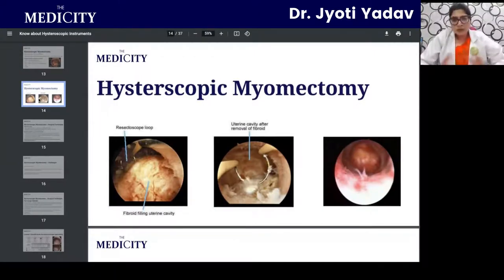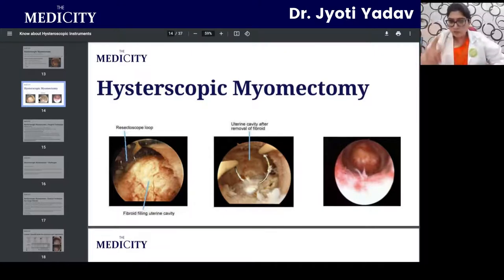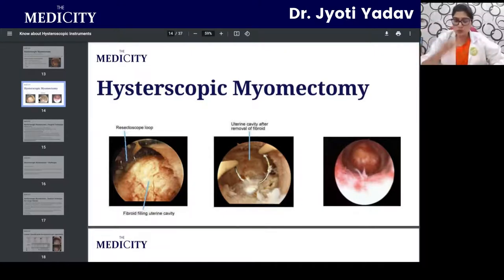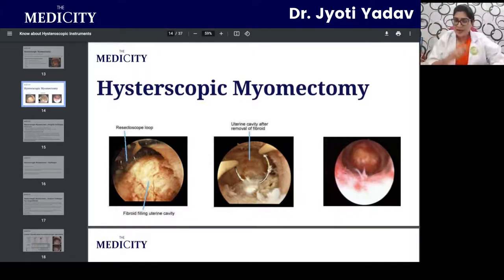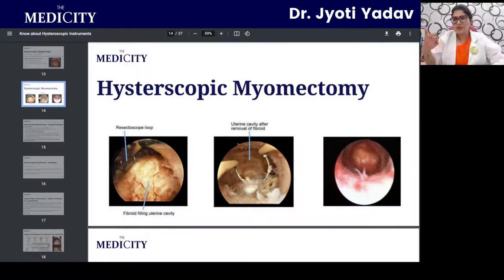Pictures demonstrate how myomectomy is performed: using a resectoscope loop, the myomas are removed in different slices as the loop rotates, and the whole chunk of fibroid is removed in pieces.